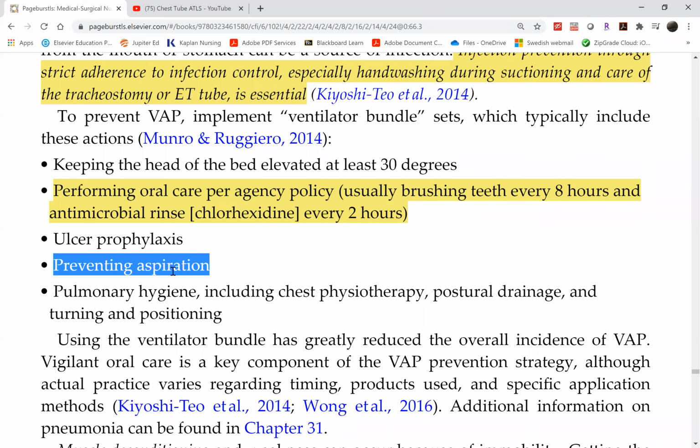The third lumen is a bunch of holes above the cuff around the subglottal area, allowing you to suction the subglottal area without shoving a suction catheter down the patient's throat. That is very convenient, because all you do is switch the suction to the subglottal area, and that will suction that area for you. Very convenient.